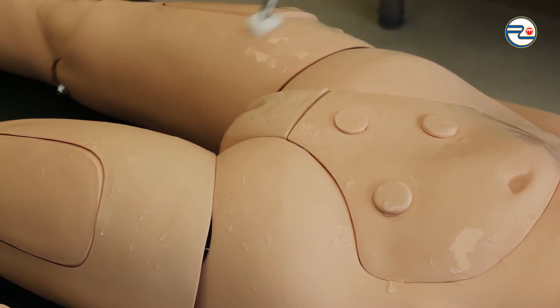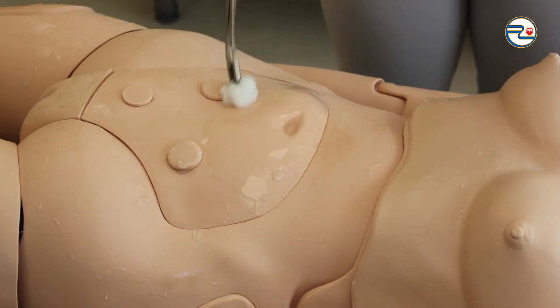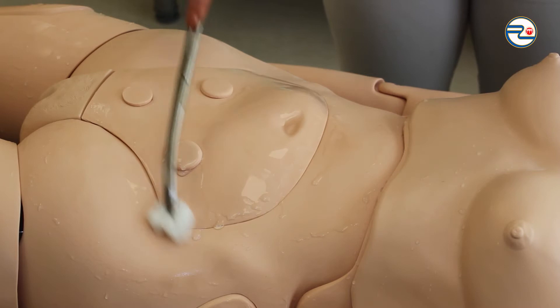Repeating the same actions, preparing the surgical site with new gauze soaked in antiseptic from the center to the periphery in circular motions two more times.